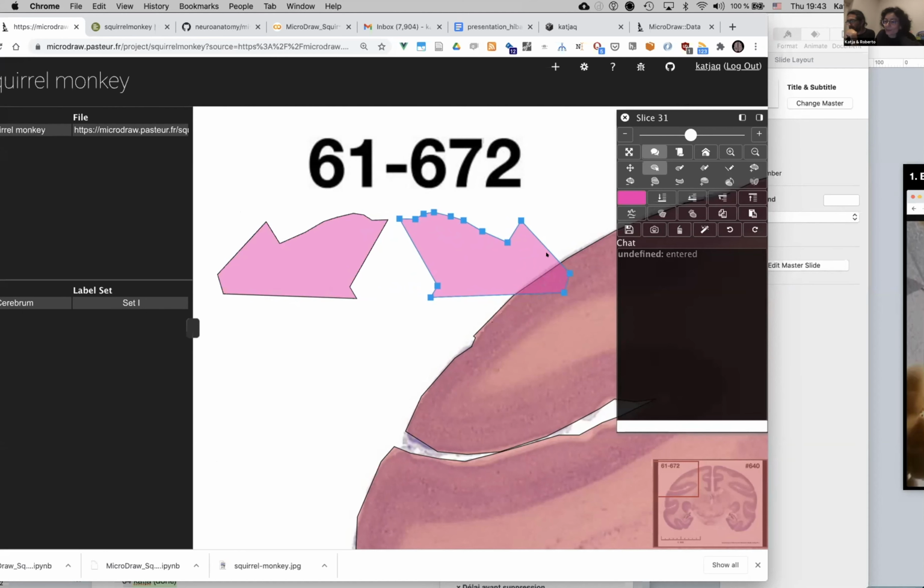You can also copy and paste regions from one slice to the other. Like if you want to see how much difference there is, there's quite some difference, but it's still interesting that it works. Sometimes in slices, your tissue is broken so that there's a piece missing. If you can copy your segmentation from the slice before to the next one, you get an idea to adjust. And you can also copy it from the adjacent slice that comes after into your broken slice. Then you can have a superposition of the two annotations from intact slices to infer what may have been your broken tissue piece.